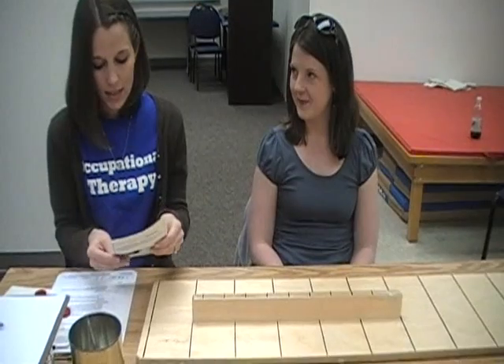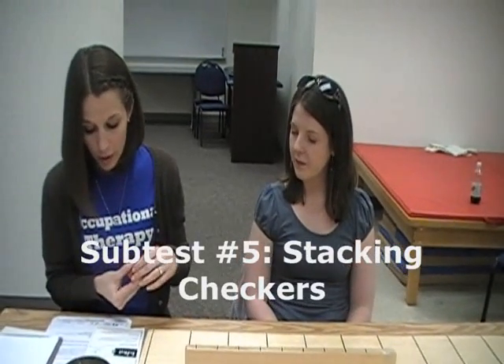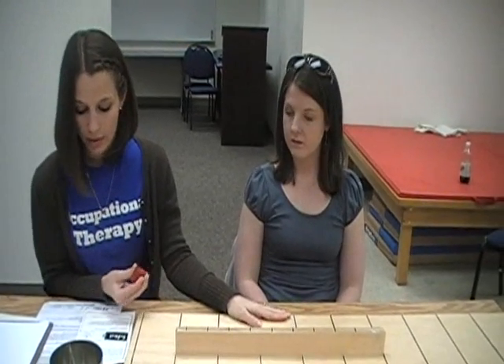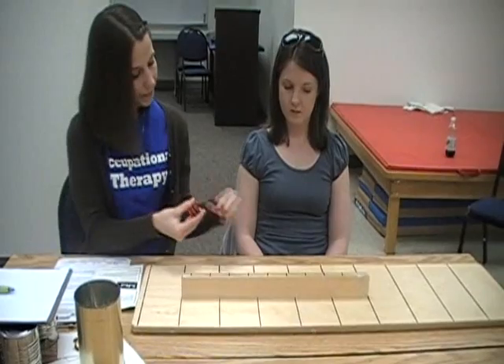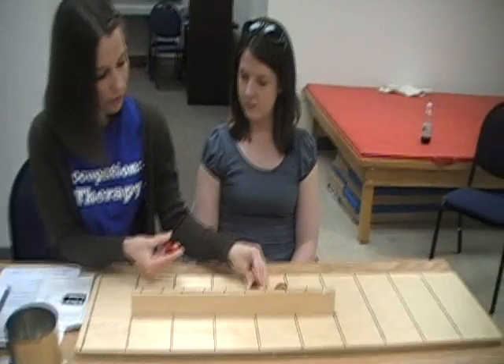The next task is called stacking checkers. You have 4 standard-sized red checkers in front of the subject, touching a board positioned 5 inches from the edge of the table. The checkers will be oriented 2 on each side of center in the following configuration.